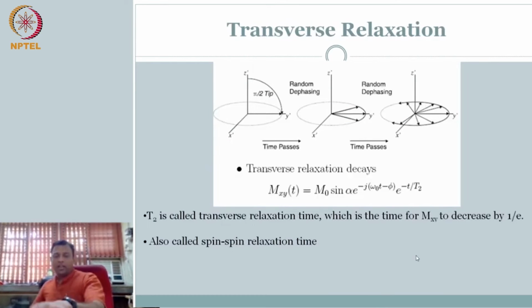Okay, we'll come to T2 star after this. You got your signal. This is your Mxy, but this is not. I mean, this is just the interpretation of how you capture this signal. That part we have not finished, but we talked about this. How do we do it?